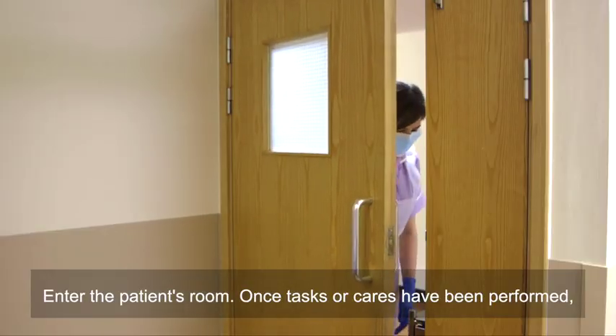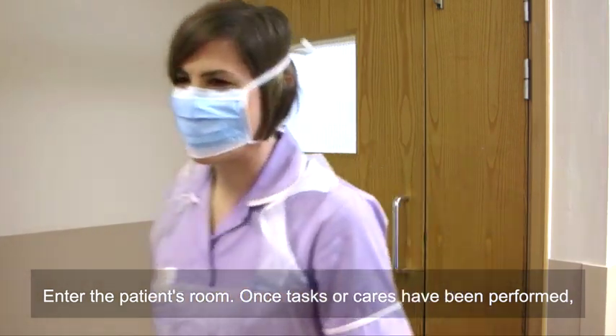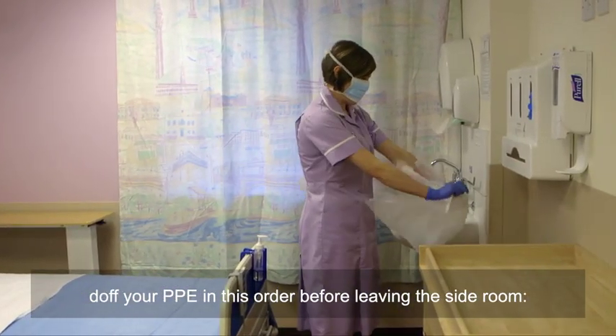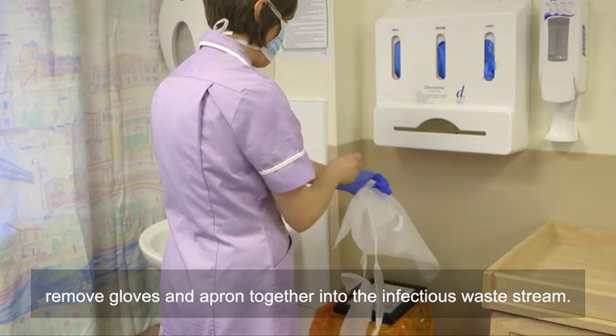Enter the patient's room. Once tasks or cares have been performed, doff your PPE in this order before leaving the side room. Remove gloves and apron together into the infectious waste stream.